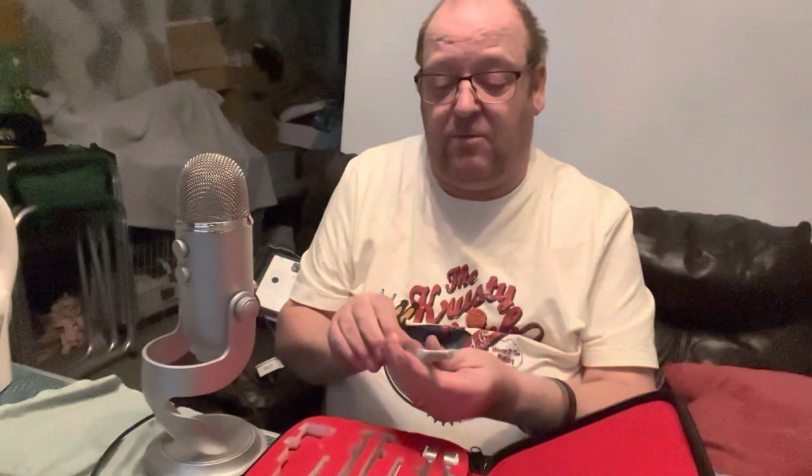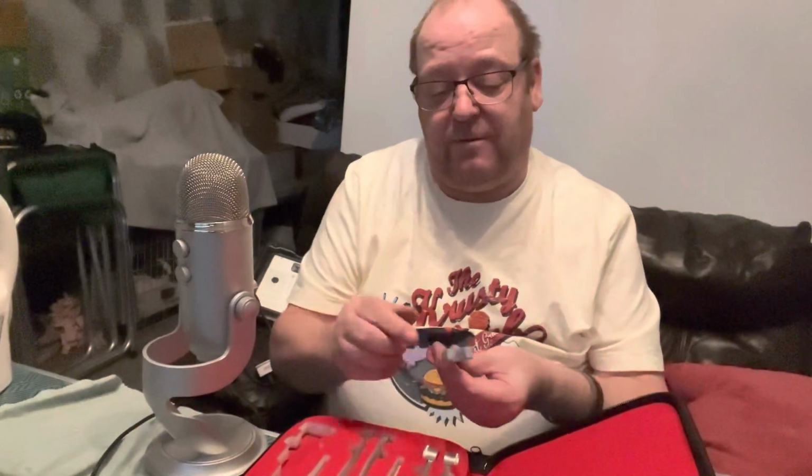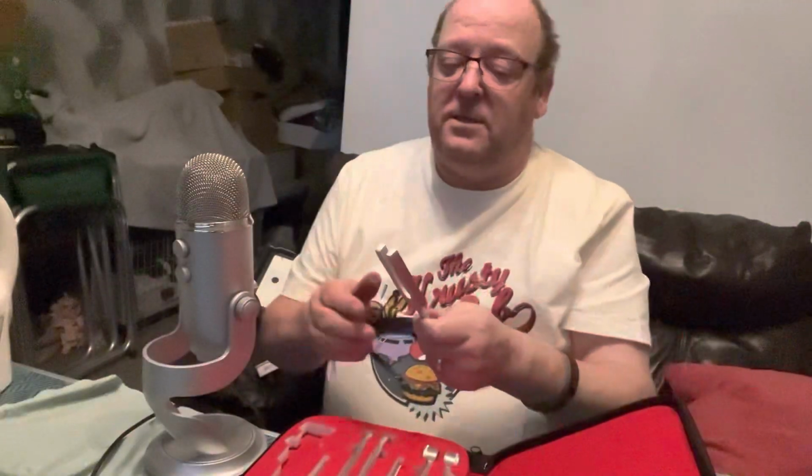My next item is tuning forks. Now, all the tuning forks are numbered. So this one is 2048C, so you can hear the different sounds. The bigger the tuning fork, the lower the tone, the lower the tune. So this next one is 1024, and again a C.